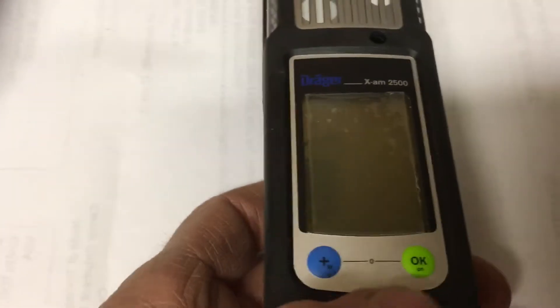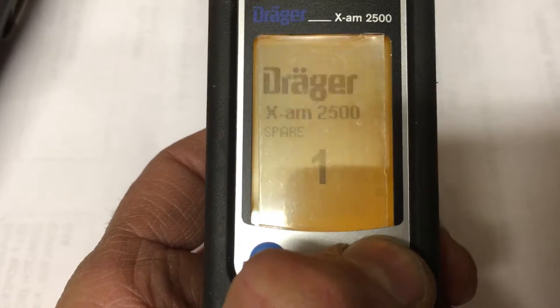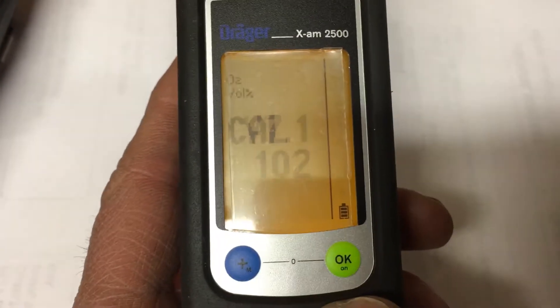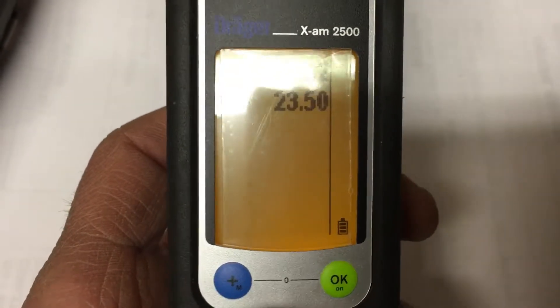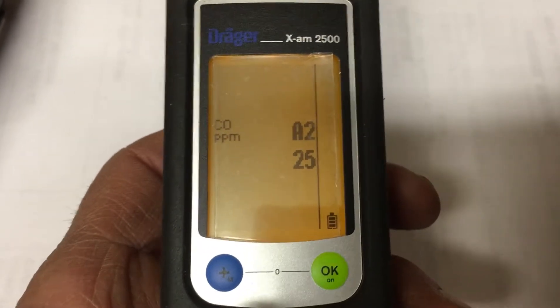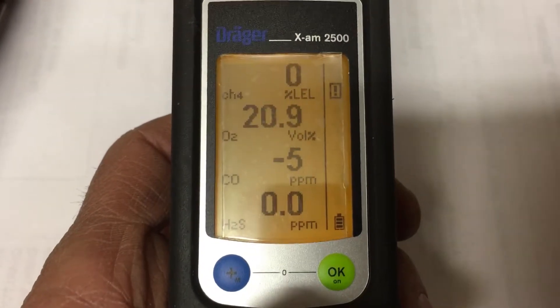To turn it on, push and hold the green button on the right. You'll get a countdown, and when you hear that little beep noise, let go. It shows how many days left until calibration — 102 in this case — so make sure you check that when you first turn it on. Then it goes through all the sensor settings.